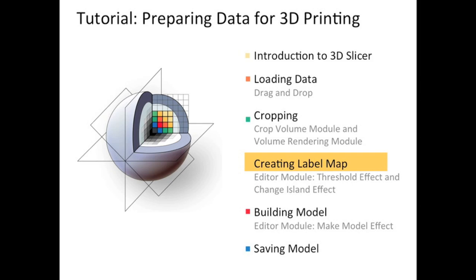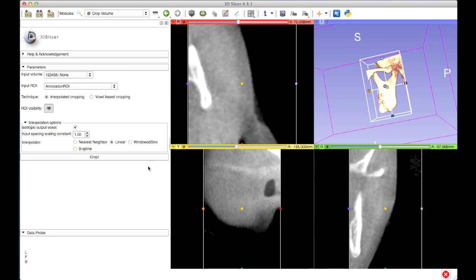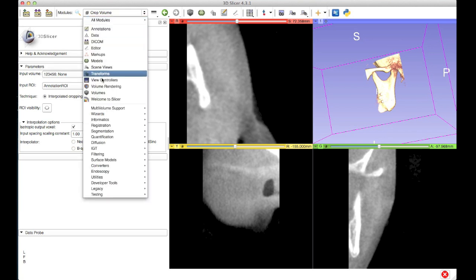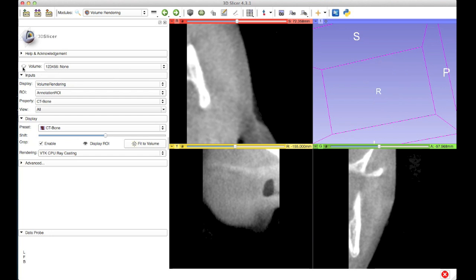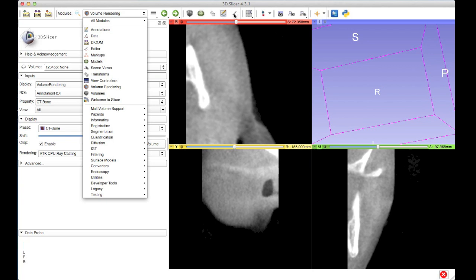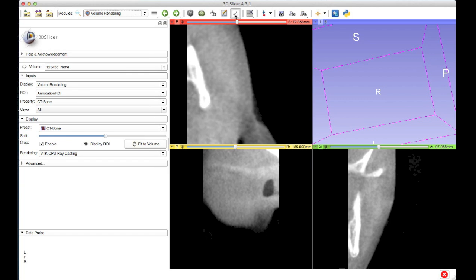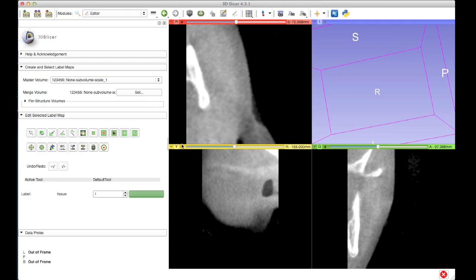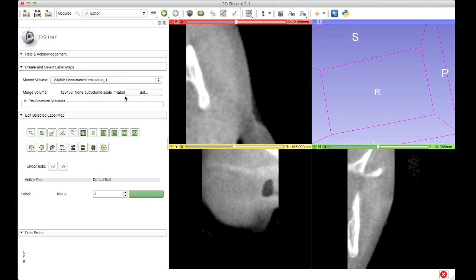Before loading the editor module, I'm just going to turn off the visibility of some of this data — I'll turn off the ROI visibility in the crop volume module, then switch to the volume rendering module and turn off the visibility of the volume rendering as well. Now I'm ready to load the editor. I can do that from either the full list of modules, the drop-down menu, or it's actually one of the core modules in the toolbar, so I'm going to click on it from there. When I do that it asks me whether I want to create a merge label map for the selected volume — I'm going to hit apply, so the master volume is that sub volume and I've created the sub volume label map.